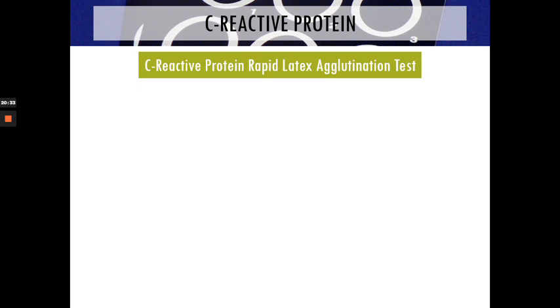Now we go to the laboratory part of our class, and I think this will be a demo of our lab procedure. This is what we will perform in the lab. So we will detect your CRP levels using the latex agglutination test. And what is the principle? The principle is reverse passive agglutination. So again, recall our lecture on agglutination methods. Di ba? What does it mean when you say reverse passive?